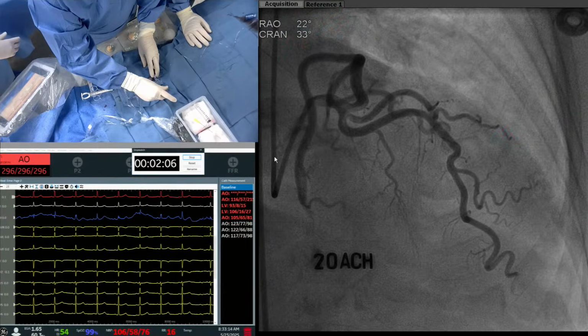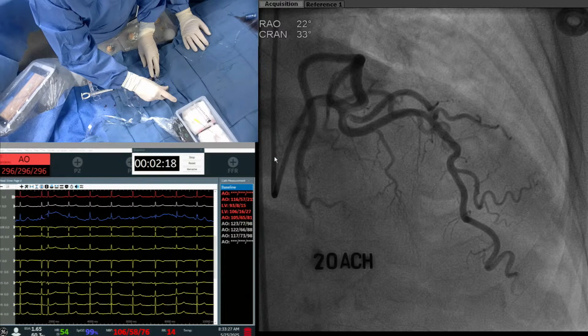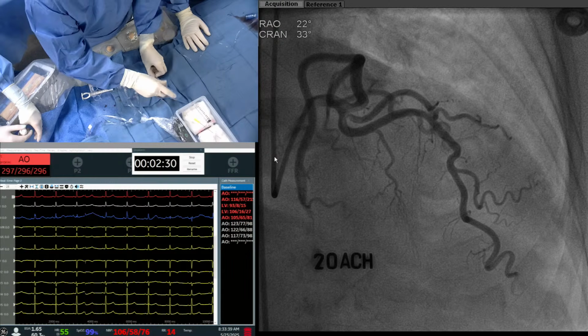Okay, so we are now displacing the 100 microgram dose. So this is our vasospastic dose, and I've displaced it about 5 cc. She's tolerating this actually quite well from at least an EKG perspective. I haven't seen any block, a little bradycardia, but nothing bad, which is great. Do you increase the rate with the higher doses, or do you stay the same, 1 minute? I usually stay the same. I try to do a minute.